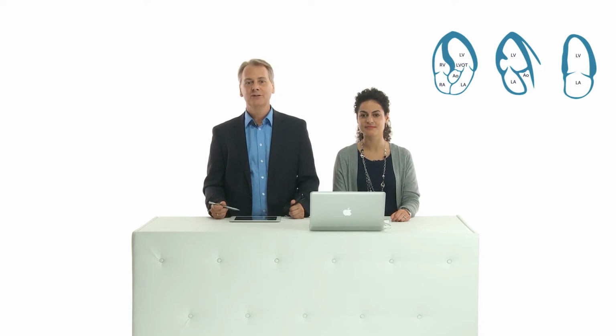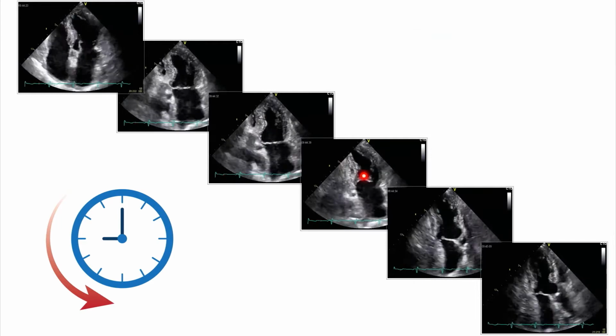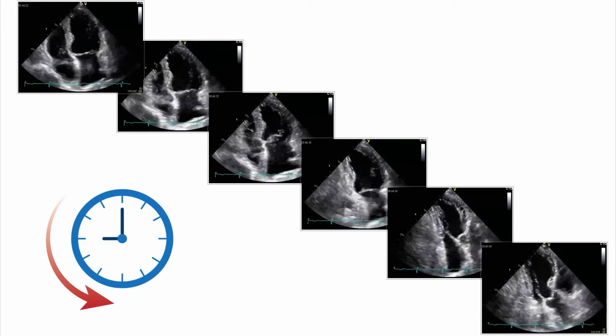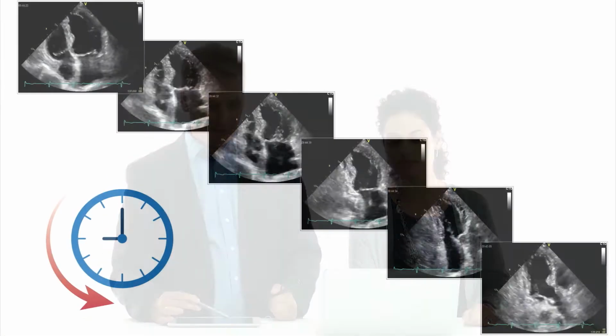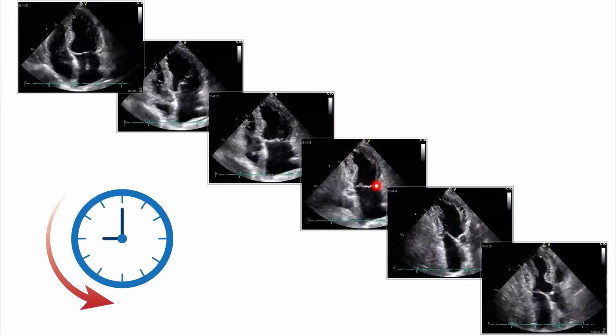The other important message here is that we see different portions of the ventricle. This will be very important later when it comes to looking at different wall motion abnormalities in different parts of the ventricle. And here I think this sequence of complete rotation from 4-chamber view through the 2-chamber view till the 3-chamber really allows you to understand. Yeah, I think the nice thing here is that you can understand how you get from one to the other. For example, right here, that the right ventricle is starting to vanish, and as soon as it's gone, that's when you have the 2-chamber view.